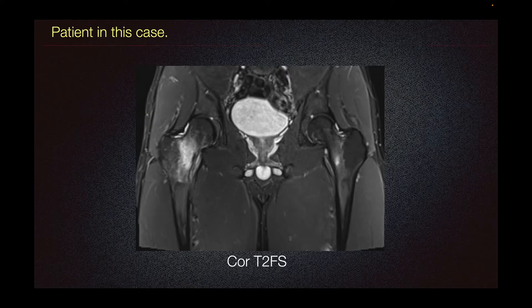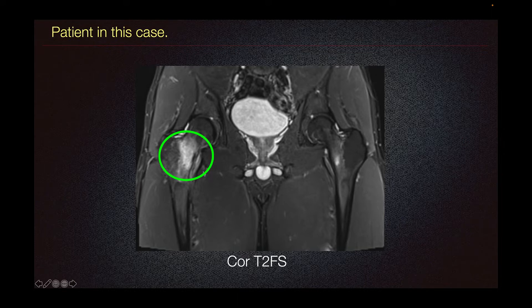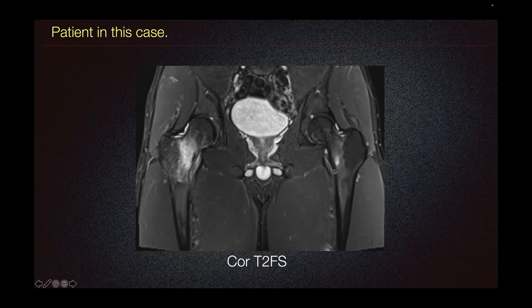The patient in this case presented with this MRI coronal T2 fat-suppressed imaging showing edema or increased signal in the right femoral neck with a band of sclerosis medially, compatible with stress fracture. Mild edema signal is also noted in the left femoral neck, but without a hypointense or dark line, likely representing stress reaction.